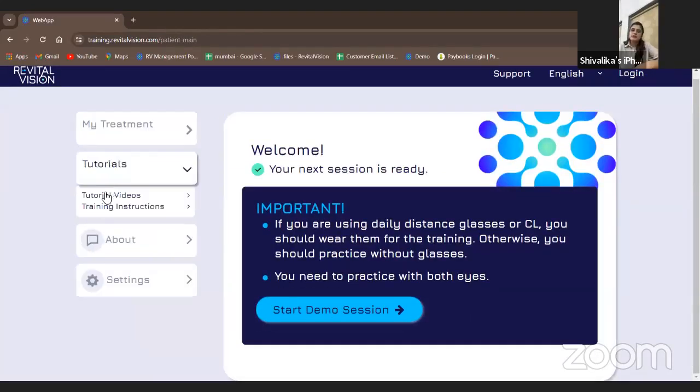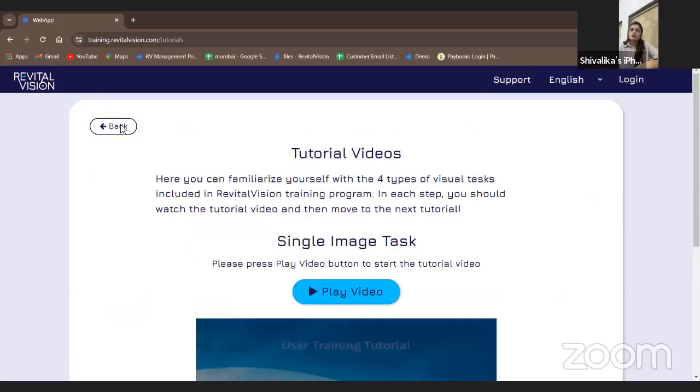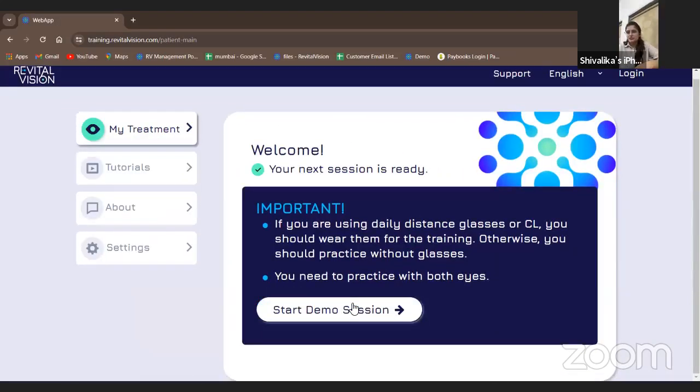There are tutorials available, videos as well as instructions. You can go ahead, watch these four videos here. Go to the main task and start a demo session. Actually, it's going to take a lot of time. That's why I'm not clicking on it. If you have a minimum 15-inch laptop, you can go ahead, check this Revital Vision UI, how it looks. It's very much easy. It's a 2-minute tutorial for four tasks. You can go ahead and see it.